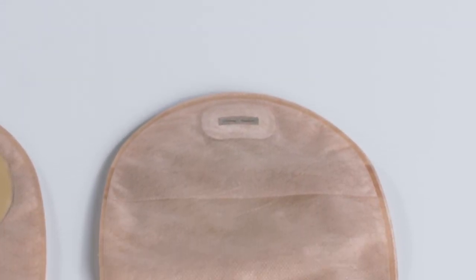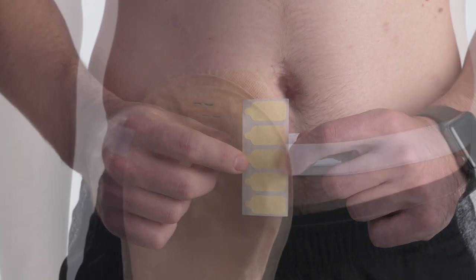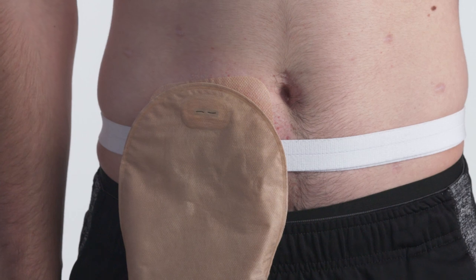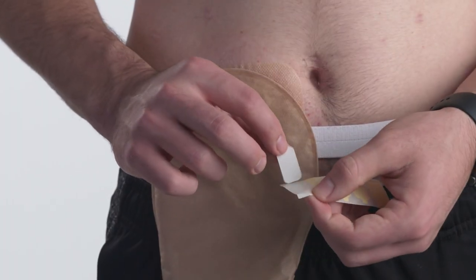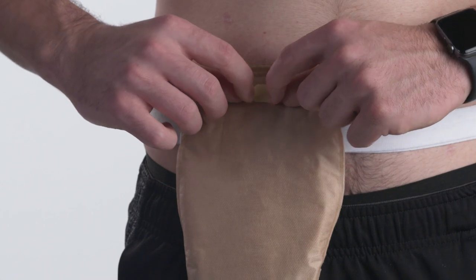Convitec filter technology utilizes a charcoal filter to allow gas to pass without an odor and minimizes ballooning. Use the provided stick-on filter covers during all water activities, such as bathing, showering, or swimming. Simply remove the sticker from the sheet, align it over the filter, and press it on the pouch.